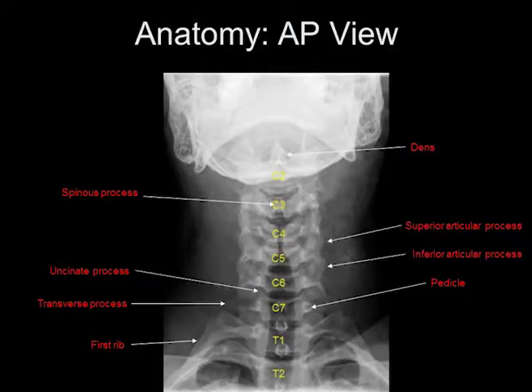You can also see the medial aspects of the first few ribs. And remember again, when you're counting the vertebral bodies, the first fully formed vertebral body you see is C2, not C1.